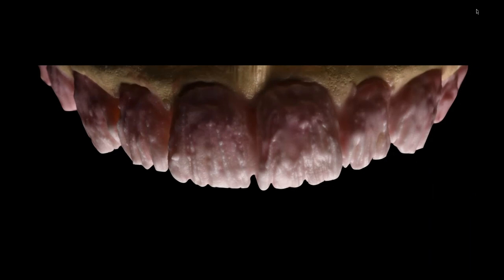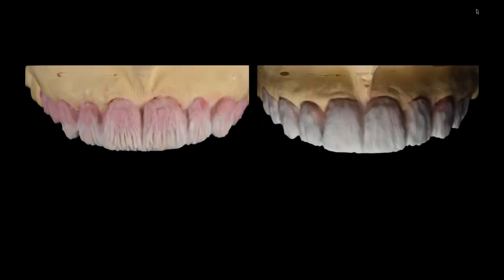I'll do very little tiny cutbacks or just kind of breaking up so light can bounce off. You can see how light is working through the zirconia on the right of your screen, meaning that the zirconia is translucent enough that we're getting some light transmission. And also I'm choosing between my opacified ceramics or less opacified ceramics to create that look where I want it to be more of a mamelon looking type structure. Obviously we cover that with enamels and that becomes our bake.